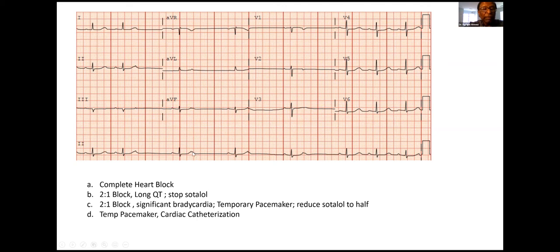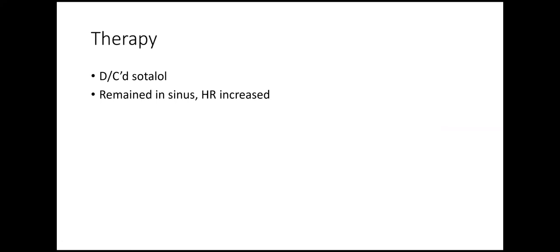Yes. So it's a classic example of sinus rhythm with supraventricular premature beats in a pattern of bigeminy which is not conducted. And physicians keep sending me these patients to put a pacemaker in. I keep refusing to put a pacemaker in these patients. And in this case, there was an offending agent, and we just need to sit tight. And then this happened before discharge.